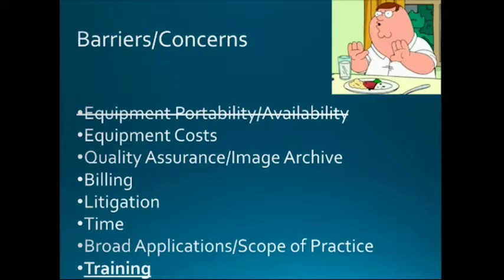And the technology is going to the point where it's integrating AI, it's integrating remote monitoring and things like that. There's one of the devices you can actually plug in, and it'll use your phone's camera to point at the patient, so you can see where your hand is on the probe, and then you can share your screen with somebody else who's observing and going, oh yeah, you actually need to come down a little bit more, or you need to slide over a little bit more.